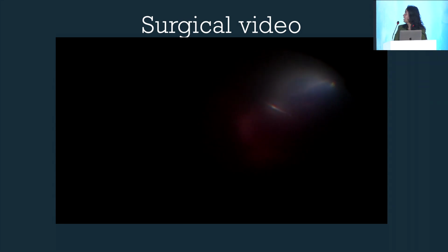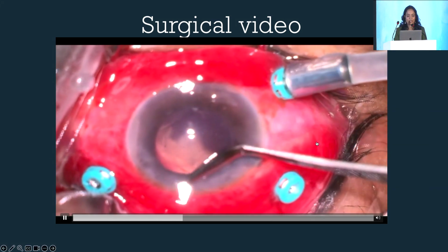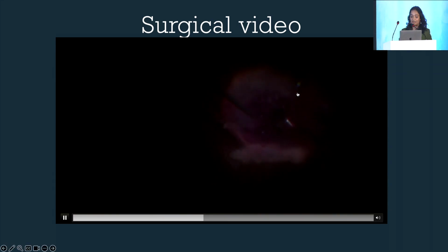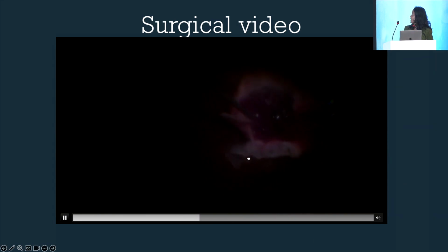These lights don't help either. So it will get better in a couple of seconds. So I decided to scrape the cornea and go in, and saw that this was the situation. There was a totally bunched up necrotic retina. I'll just show that again. This is all bare RPE that you can see.